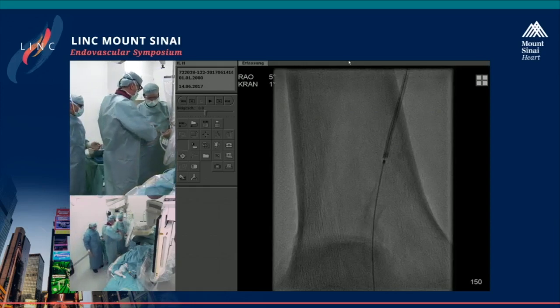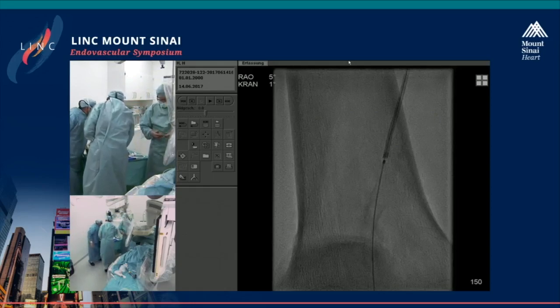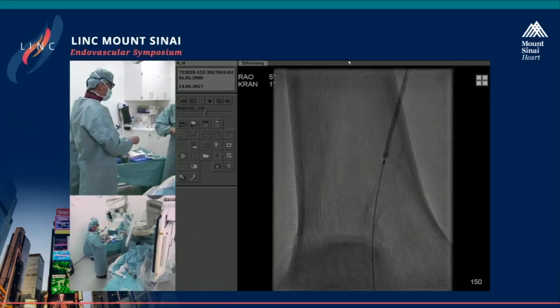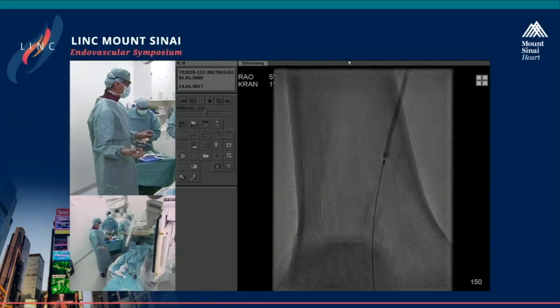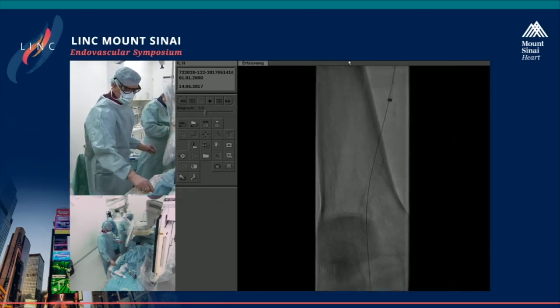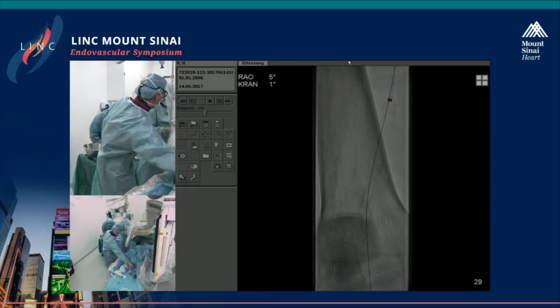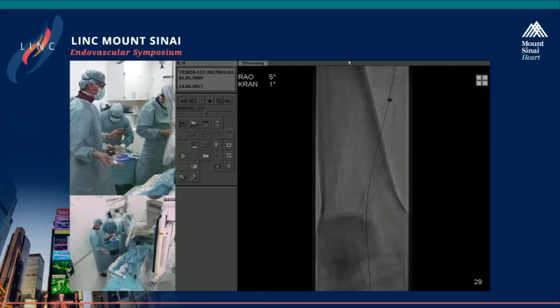Actually, yeah. First, we try to balloon this vessel only without stents. I think this is not really a good lesion or area for stenting. Of course, if it would be short, no problem with a drug-eluting balloon implant, the stent, or a Supera, more proximal. But here, the lesion has a bigger diameter proximal and small distal. So therefore, it's difficult to find a good stenting solution.